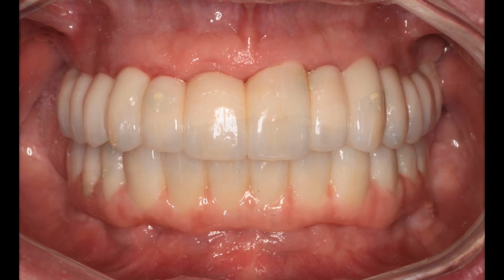And here you can see that left front and left second tooth, the left central incisor and the left lateral incisor, are longer. But as you recall, he had 100% bone loss around that left lateral incisor, but we were able to still finish his case without any pink zirconia on the upper.